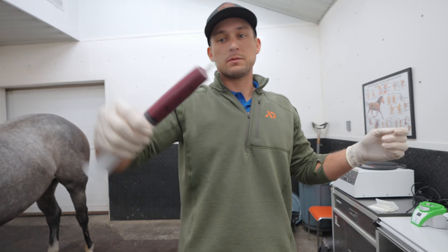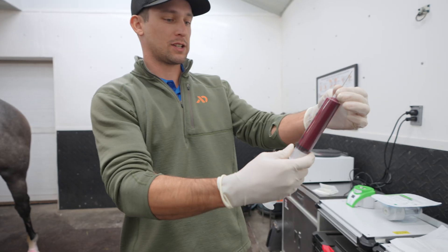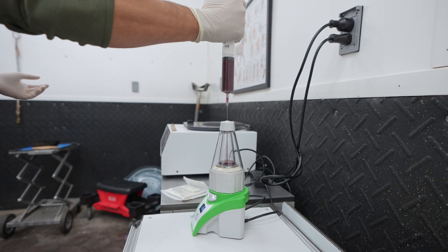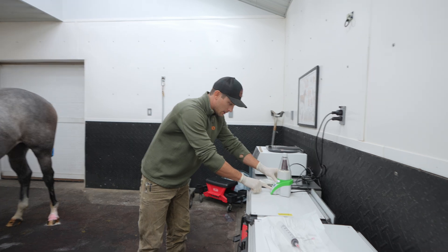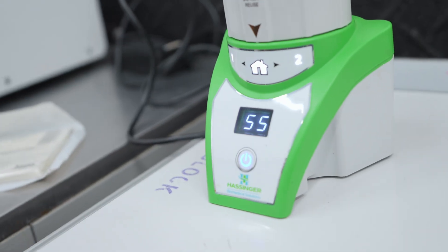We invert it multiple times to make sure the blood thoroughly mixes with our anticoagulant — again, we want to keep all those platelets in suspension, not clotted. Then our anticoagulant-loaded blood goes into the centrifuge system, and it does its initial 60-second spin.